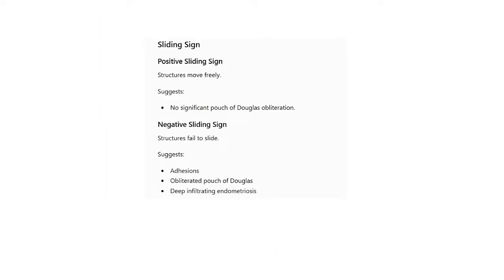Now let's talk about what's called the sliding sign. Do you know about the sliding sign, guys? Have you ever heard about the sliding sign? Do you also check on it when you are assessing for endometriosis?